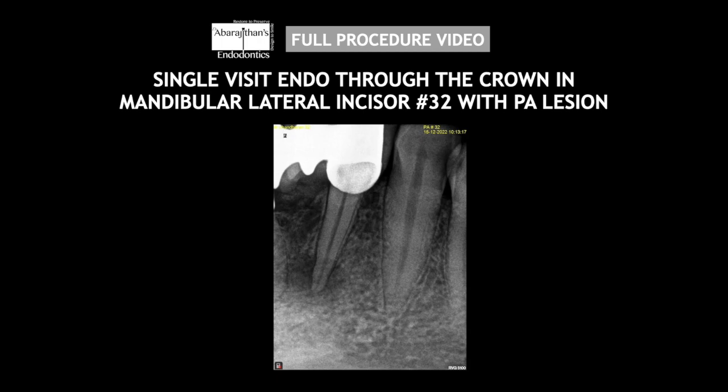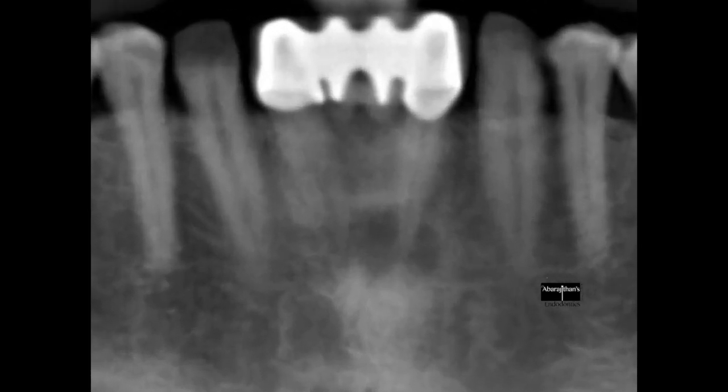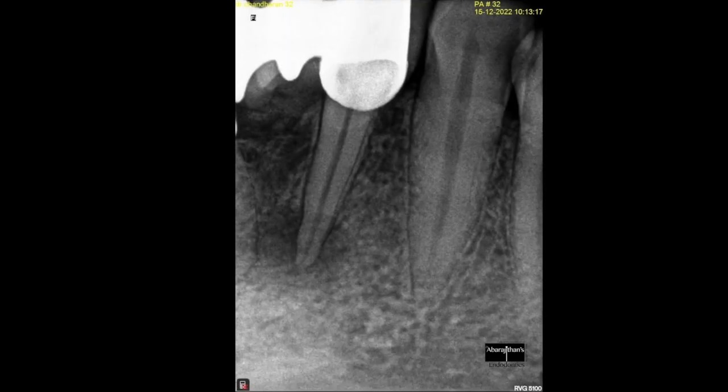Hello friends, welcome to Endo Tales from Life. In this episode, we are going to see a full procedure video of an endo done in single visit through the crown in a mandibular lateral incisor with periapical lesion and an intraoral swelling. The patient was referred to me with a radiograph and I was requested to do endo in tooth number 32. I generally personally do not prefer OPG as a pre-op radiograph, so I repeated my intraoral periapical radiograph. I decided to do the endo through the crown as recommended by the referring dentist, also seeing a sufficient satisfactory functioning prosthesis that is existing.